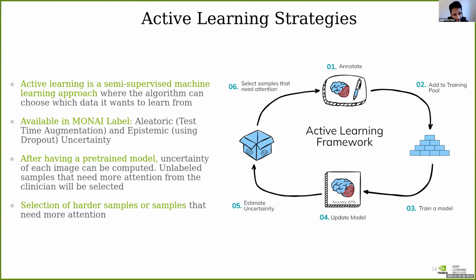And with that, I'll finish the first part of what MONAI Label is and the things that you could do to train your own model. And in the second part, I'm going to show the different radiology use cases and, in more detail, how you can train models on different data sets or fine-tune the model on a different data set than the ones that we provide. Thank you, Michael, or Steve.